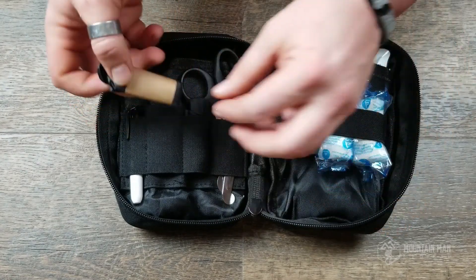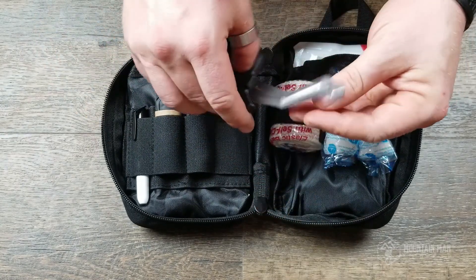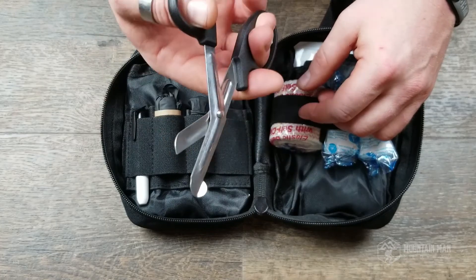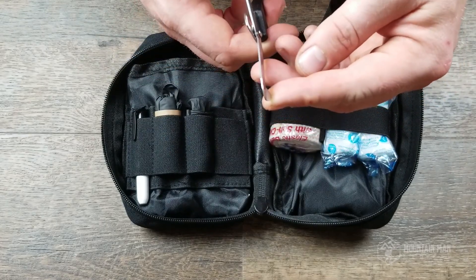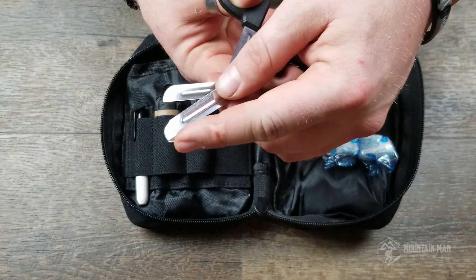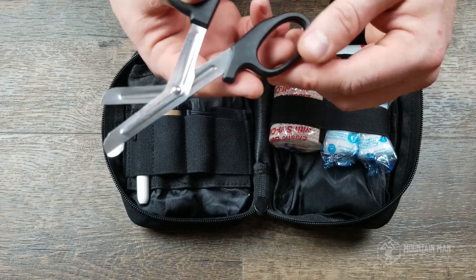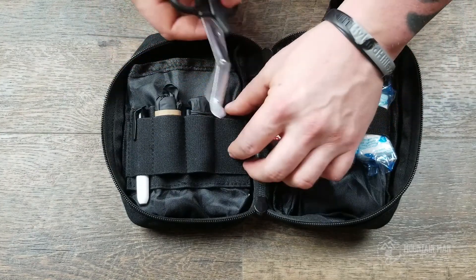The two pairs of gloves also mean that if you've got someone helping you out and they need gloves as well, you've got a pair for them. Also included are trauma shears — I've used these, they work. You can zip off somebody's clothes in no time at all. It's got a blunt end so you can just run it down their leg and cut through clothing quickly.